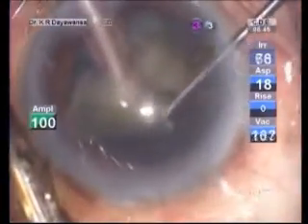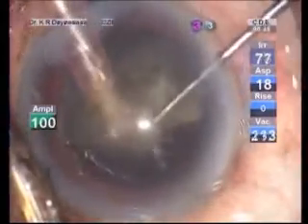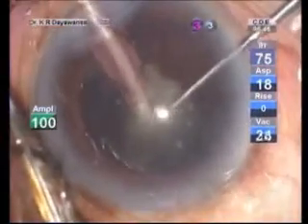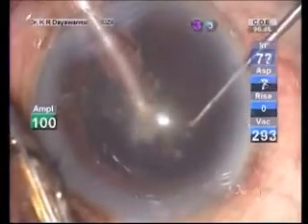In between the procedure, we may have to inject dispersive viscoelastic to coat the endothelium. This technique is safer and uses little energy to remove harder dense cataracts. When it comes to the last fragment, you must be careful.